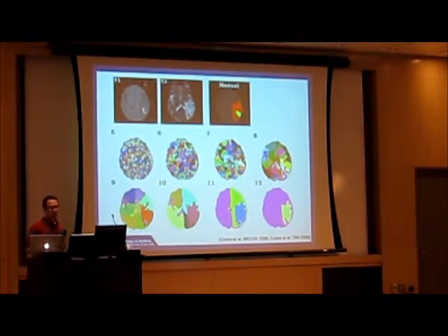So take this image here. This is a T1 scan of a patient. This is the same patient but a T2 scan. So T2 is more sensitive to water, so it gets a swelling in the brain, which is this whiter stuff here. Whereas the T1 scan will focus on the blood, right, in the tumor.